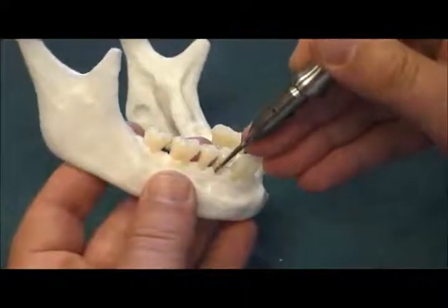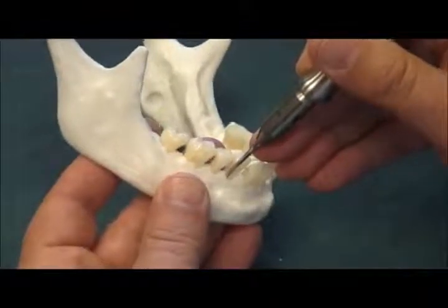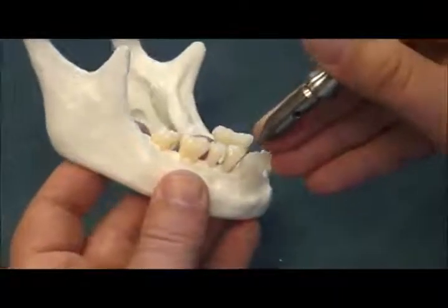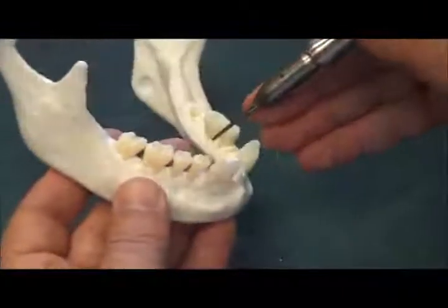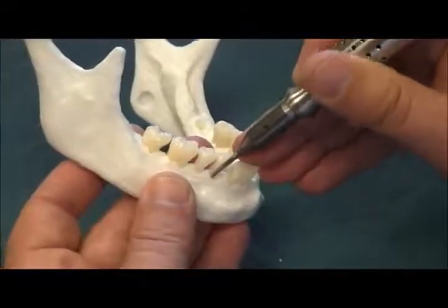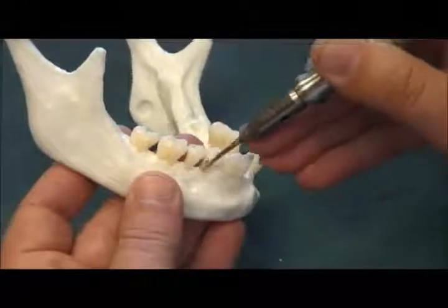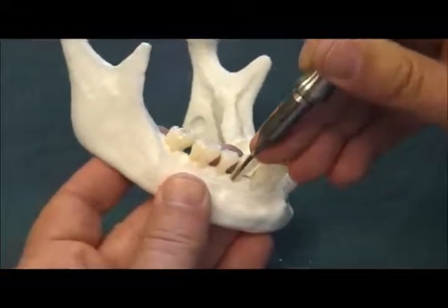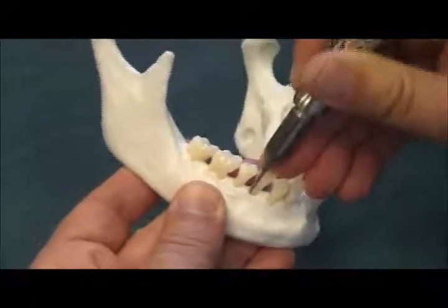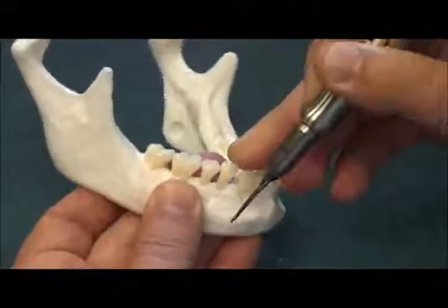But once you've reflected a flap, you either want to go on to one of the buccal line angles or facial line angles, whether it's the mesial buccal or distal buccal line angle. That's where the bone's a little bit thicker. You're not going to have a tendency to fenestrate the bone on the buccal, and the bone tends to be a little bit softer there. So initially, I'm going to the distal buccal line angle area of this tooth, and I'm applying power, and the tip of the instrument goes right into that periodontal ligament space.